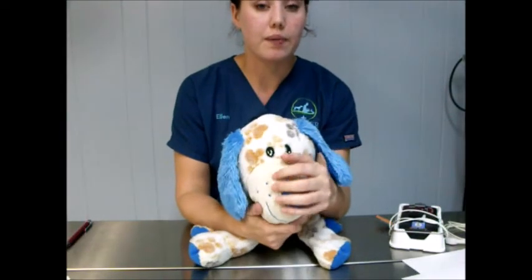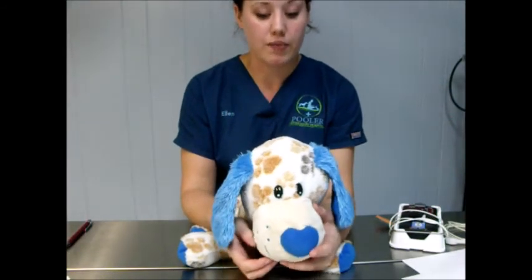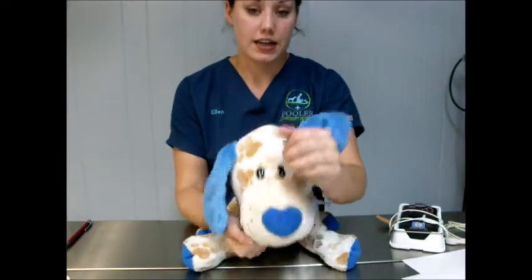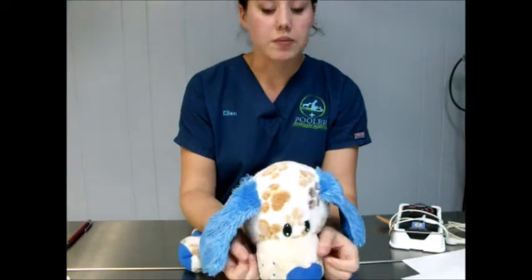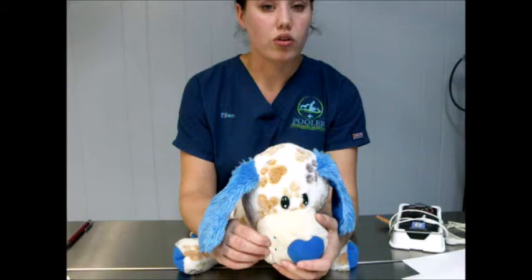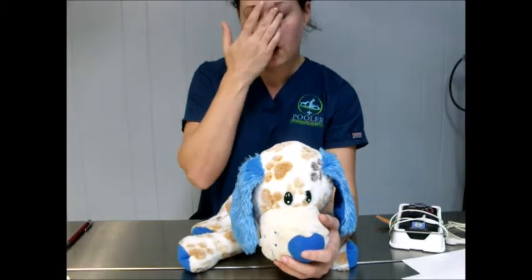Jaw tone, pretty good for when you're inducing anesthesia. So of course that would just be opening the mouth, seeing how tight the jaw is, see whether you can intubate or not at that point. Obviously going to be lost at deeper anesthetic depths.